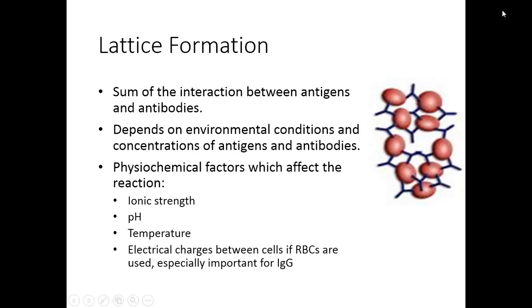So sometimes we'll use a protein that can diminish the electrical charge a little, which will allow these red cells to come a little closer together, or we have to use IgG or IgM molecules. IgG has a short wingspan, how far it can reach to grab an epitope between two different red cells. IgM is a big monster of an immunoglobulin, so it's a great reaction for red cells that don't want to stick together. So we need to make sure that we monitor that when we're developing test methods. We'll talk about that a little bit more.